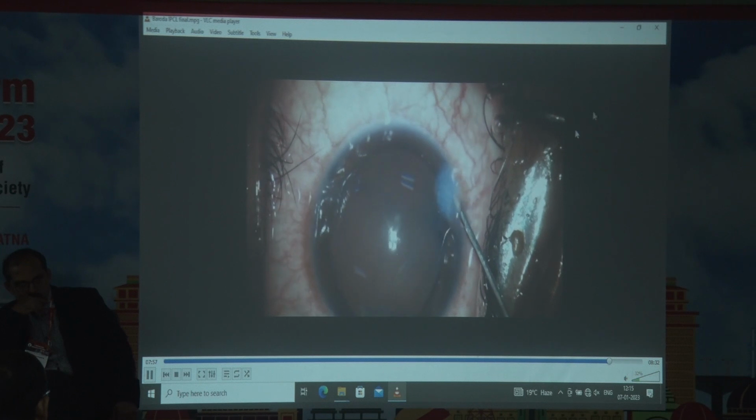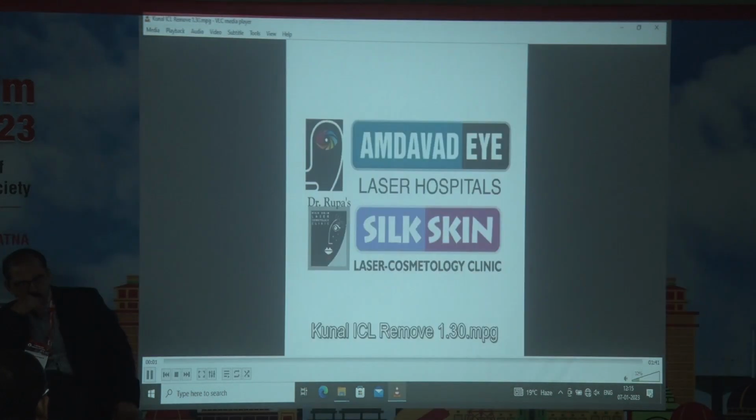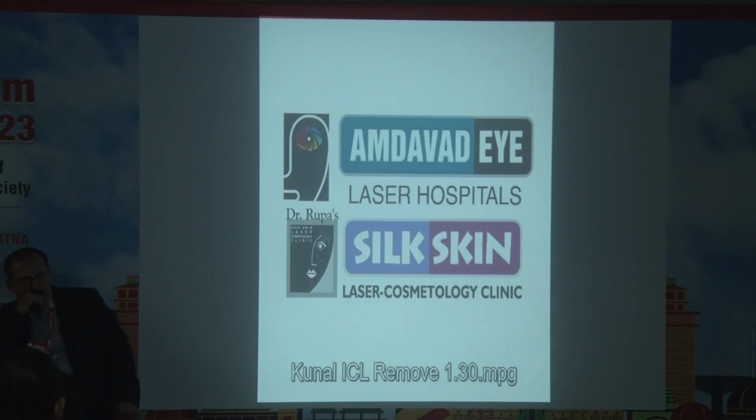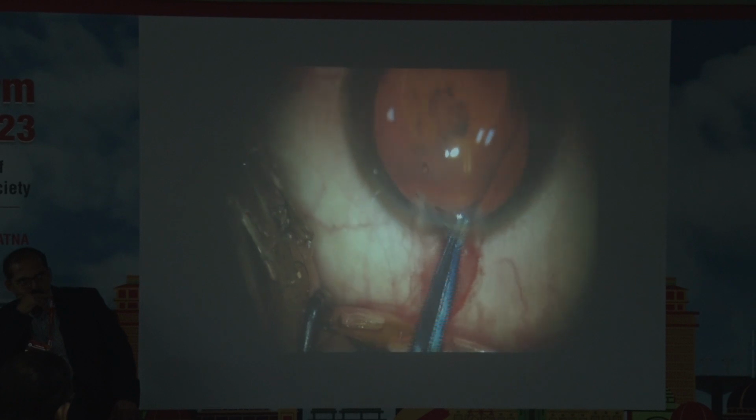So this was one video, and then I have one with cataract. Yes, the pupil did not. There's a name to that syndrome which I keep forgetting.